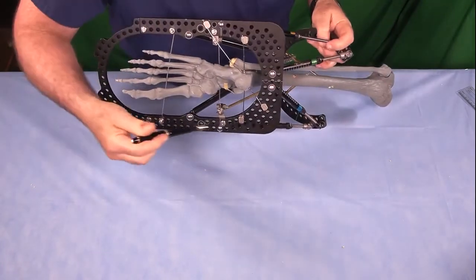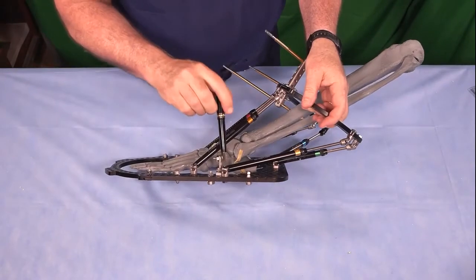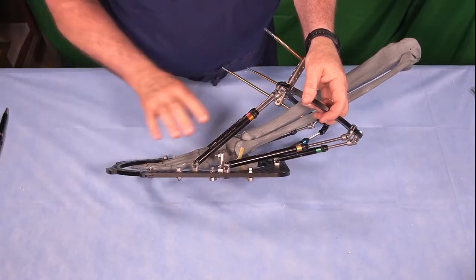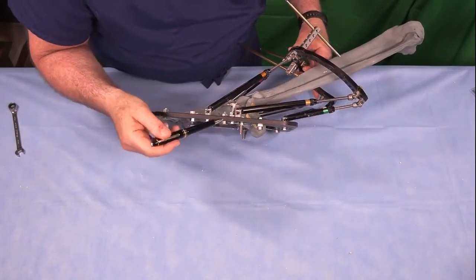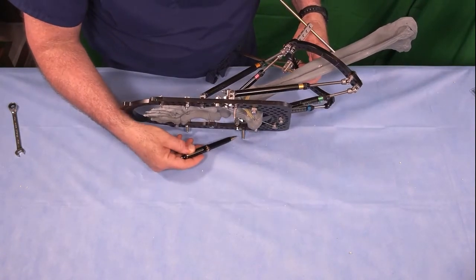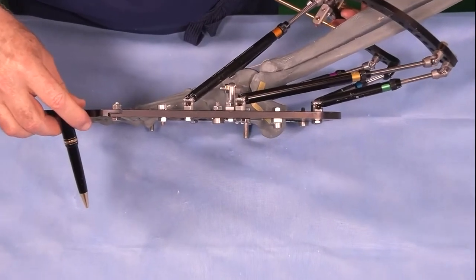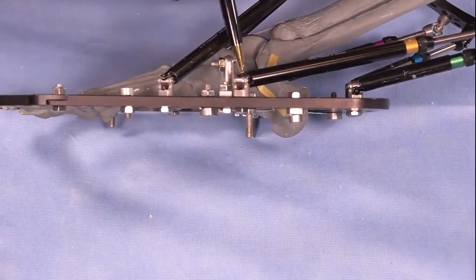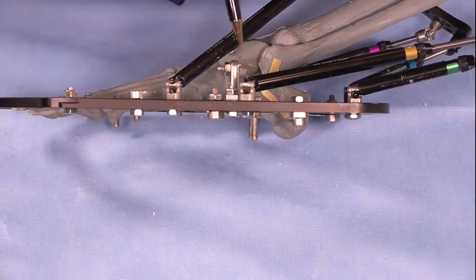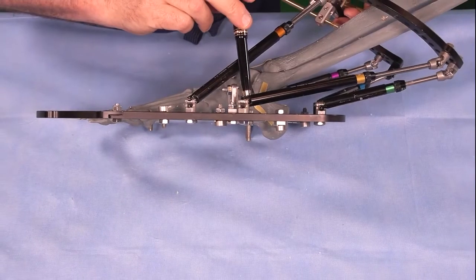I don't know if you can see that here, the white lines, the center lines which denote the center of this ring, fixed with a marker so that we can gauge the mounting parameters for the foot. I've placed a long 30mm bolt at the center hole of this ring and one over here. When I go to take my x-rays, I'm going to line those 2 bolts up so that we get a gun sight view, and that represents the center of the ring and our mounting parameter, which in this case, since the center of the deformity is in the subtalar joint, our offsets are probably 0.